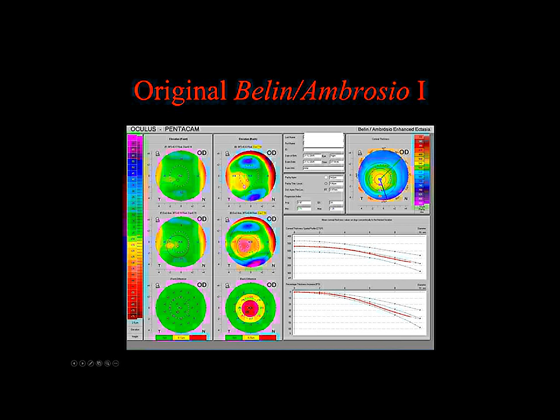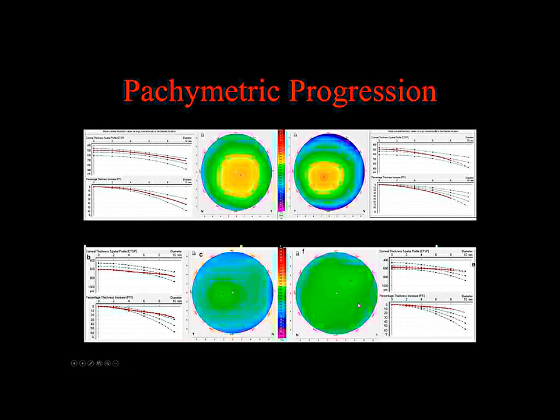Here, again, the back surface, notice you see an early ectasia becomes highly magnified using the enhanced reference surface. And here you can see, again, the change, which is highly significant. This is the corneal thickness map, and these are two pachymetric progression maps that I will describe shortly. So Renato's, the right half has to do with all pachymetric data, and these are Renato's pachymetric progressions.